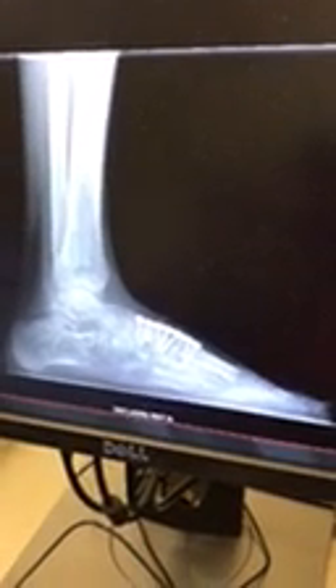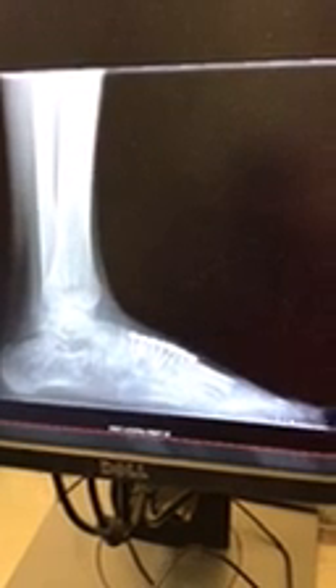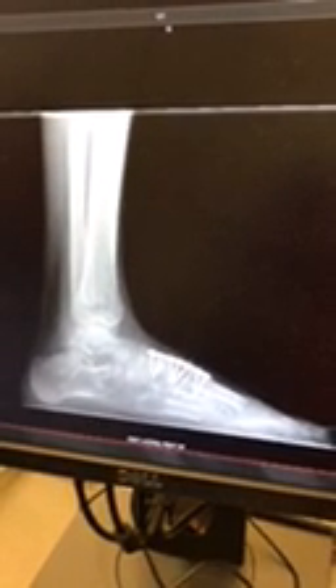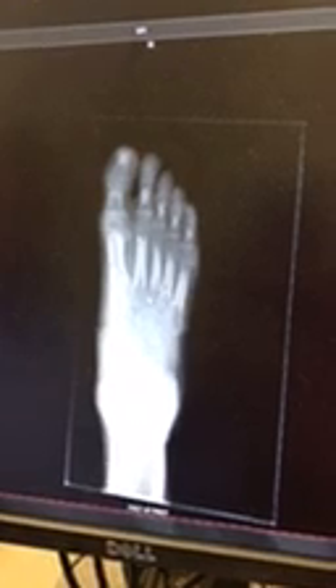Let's see the x-ray. If you can zoom in — so basically, in a nutshell, as we can see, the plates and the screws, and you can see the alignment of this bone called the talus, shooting down to the big toe. Everything is straight-lined. Some people consider this the Meary's angle. Nonetheless, we had to use bone grafts, and everything is where it needs to be. All the bones were fused, as you can tell, and solid.